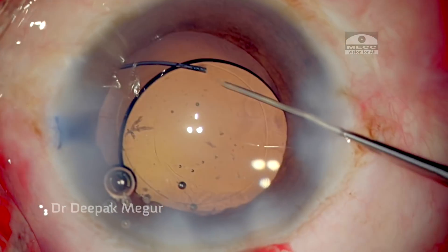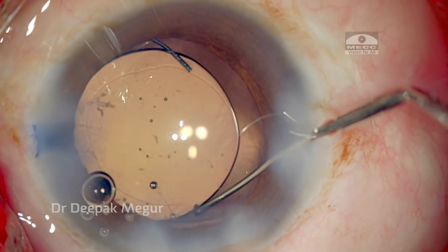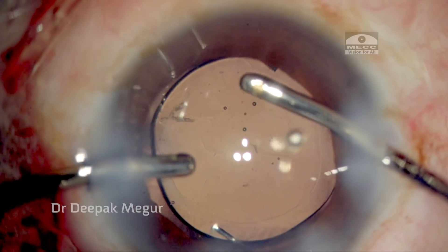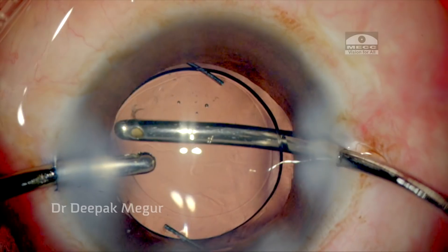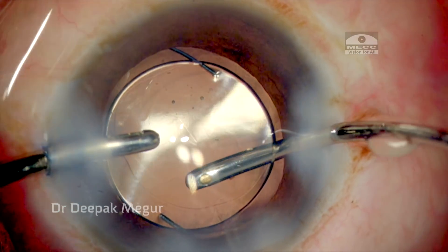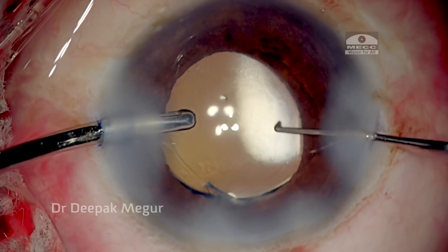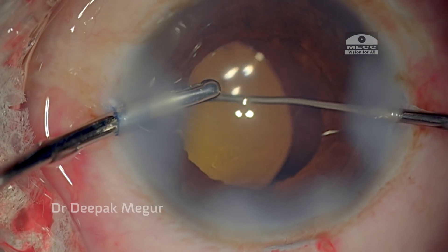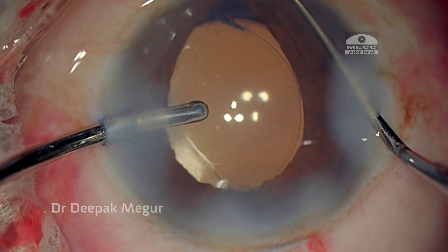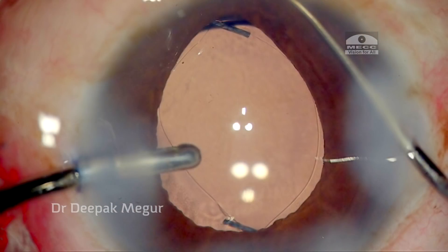I want to achieve an optic capture, but before doing that it's critical that I remove all the cohesive OVD present both in front and behind the lens. Once the cohesive OVD is fully aspirated, irrigation is maintained by my irrigation handpiece and the dialer pushes the lens posteriorly to achieve the tuck — where both edges of the optic lie behind the capsule while the two haptics remain in the sulcus. Ovalization of the rhexis is a clear indicator that optic capture has been perfectly achieved.